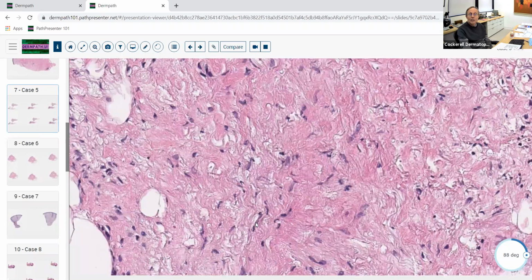And if you look here at these elastic fibers, and even here you can probably just barely see them, they've got this brownish gray discoloration, and that is due to the gadolinium that is precipitating on those elastic fibers. I'm not sure exactly what the pathophysiology is as to why the gadolinium causes these fibroblasts to increase in number, but they do. Perhaps the gadolinium precipitates on these elastic fibers, and the fibroblasts say, hey, what's going on here? And it somehow turns them on. They shouldn't be proliferating quite to the degree that they are.